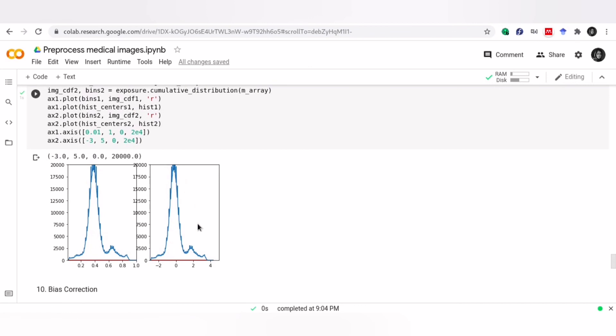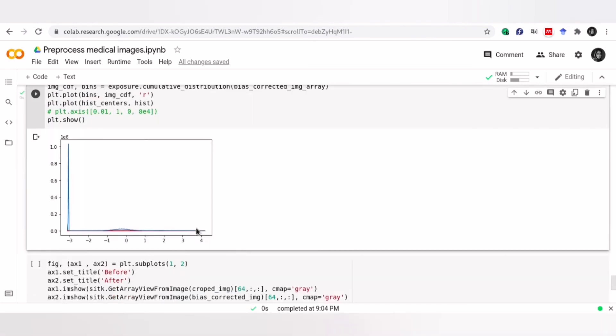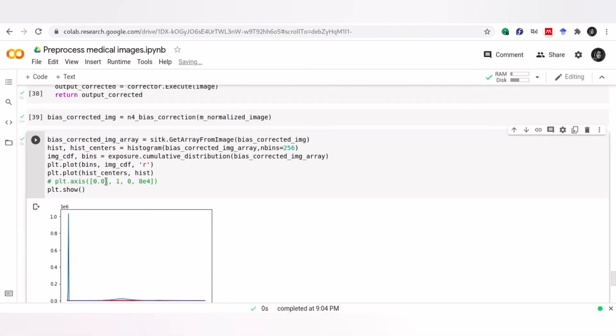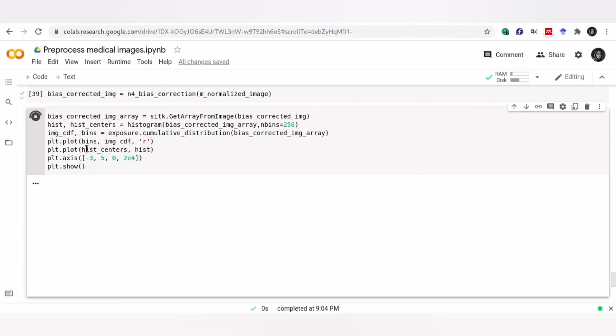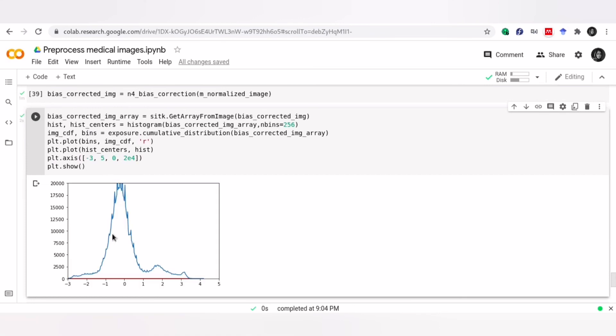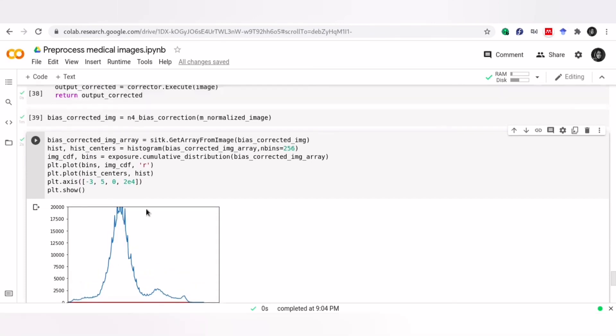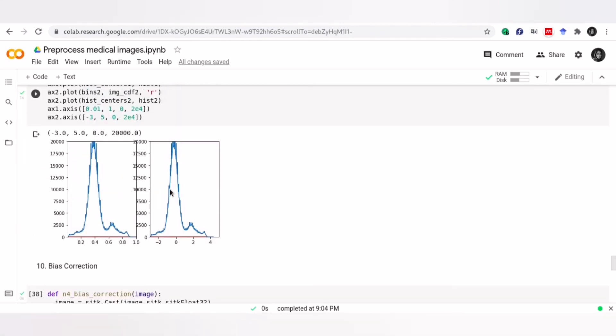This is our histogram before we apply N4 bias correction filter. Let's zoom to see the histograms better. This is the histogram of our corrected image. And now we can compare it with the previous one.